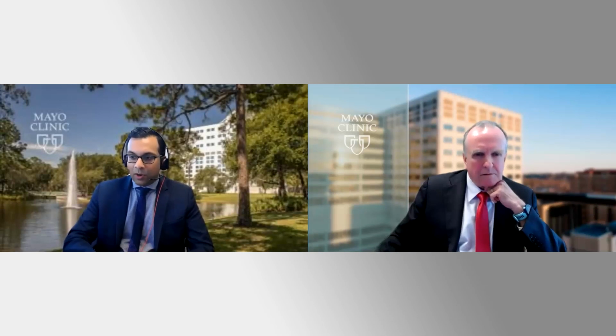Yeah, absolutely. As all of us look at this ECG and try to say, is this characteristic of pericarditis alone? There have been many situations where I haven't felt confident enough just looking at the ECG to say that this is pericarditis and there's nothing else on the differential. If everything falls into line from a clinical presentation perspective, it's one thing. With laboratory testing, we get that pretty quickly. Obviously, in a STEMI situation, it's still really important to make that diagnosis quickly. But if you have a troponin, or even a point of care troponin, that is elevated, that should raise your suspicion that there may be something else going on. Even if it ends up being a myocarditis along with the pericarditis, it still tells you it's not as simple as just pericardial inflammation. So the traditional pericarditis alone shouldn't be giving you a troponin elevation, and it certainly shouldn't be giving you regional wall motion changes on an echo.